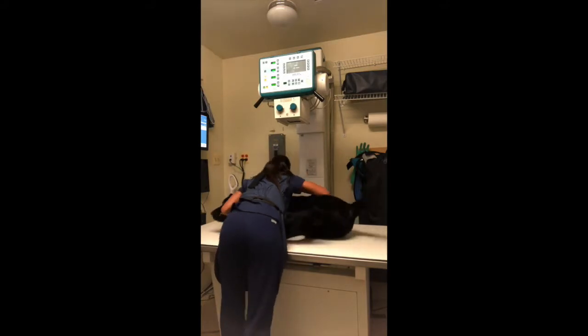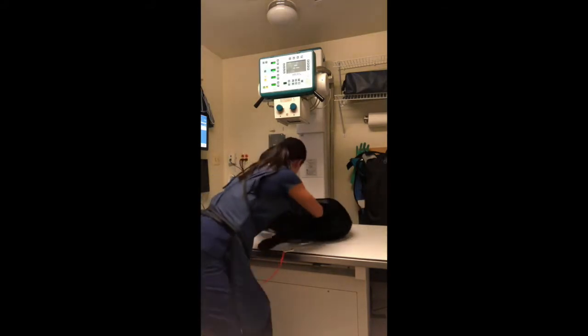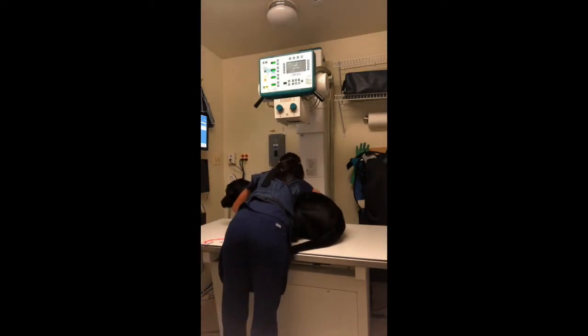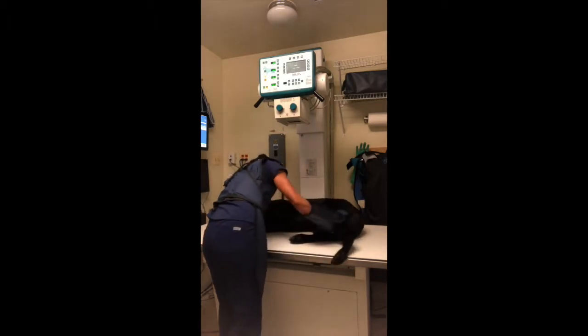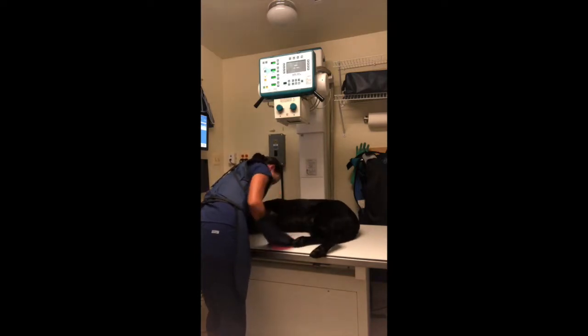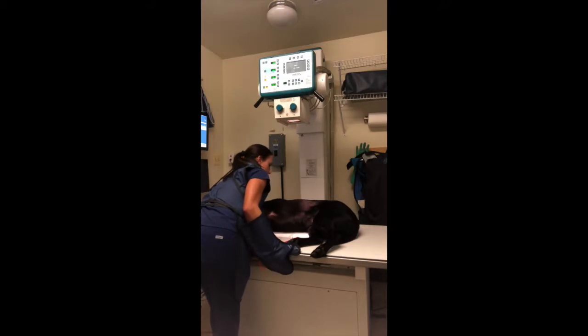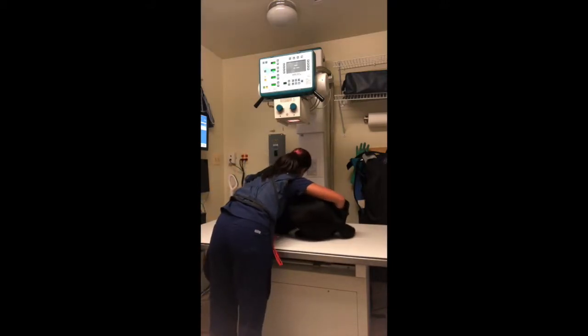For radiopaque markers such as BIPS, which are given by mouth, in addition to the pros I listed earlier, the other pros include that the time frame for radiographs is not as important. They do not obscure abdominal details. They're more likely to detect motility disorders. The cons are that you cannot visualize mucosal detail and luminal margins. They're expensive compared to the barium suspension, and studies can take longer.